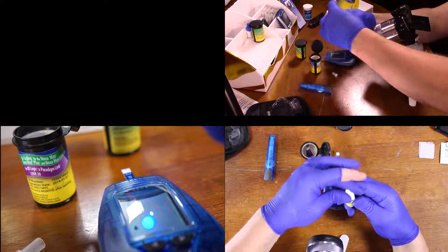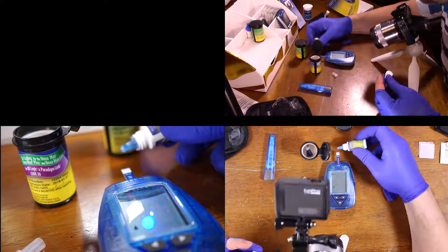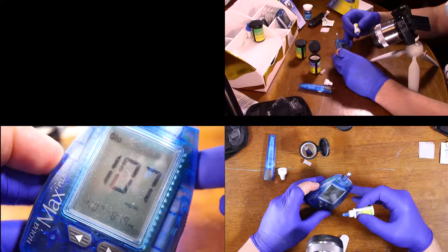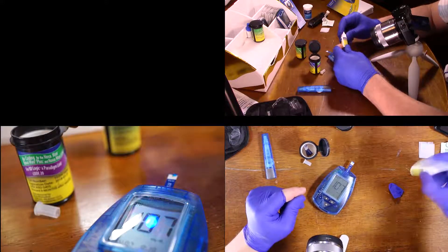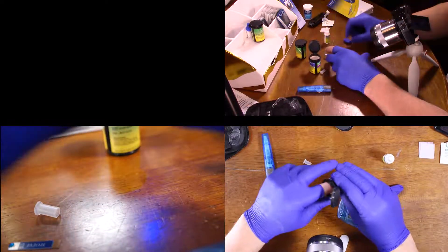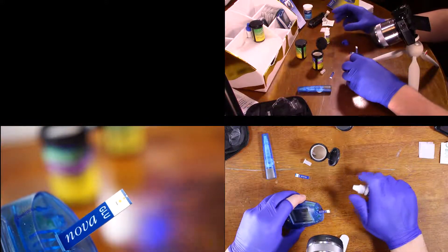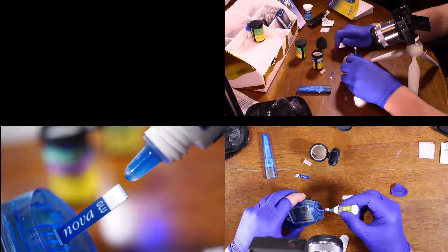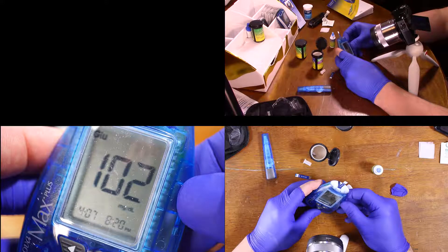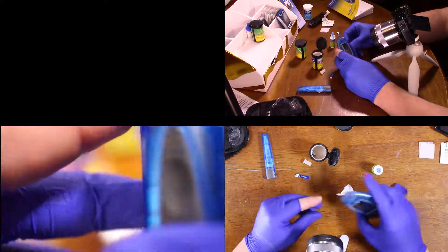Let's get a control solution reading. Let's shake it up and then go ahead and put it in here. I think what we're supposed to do is be pretty close to 100.